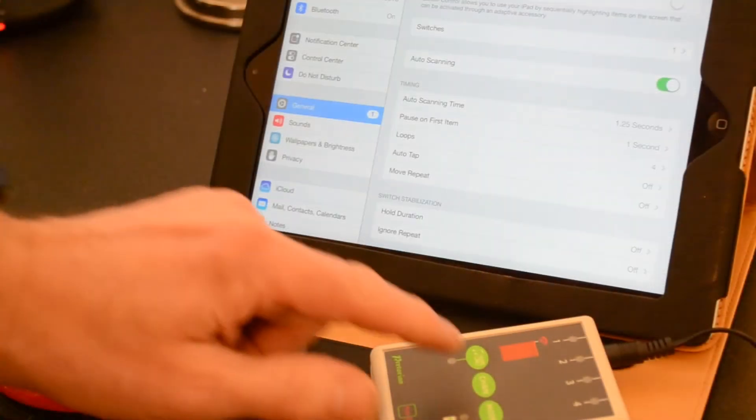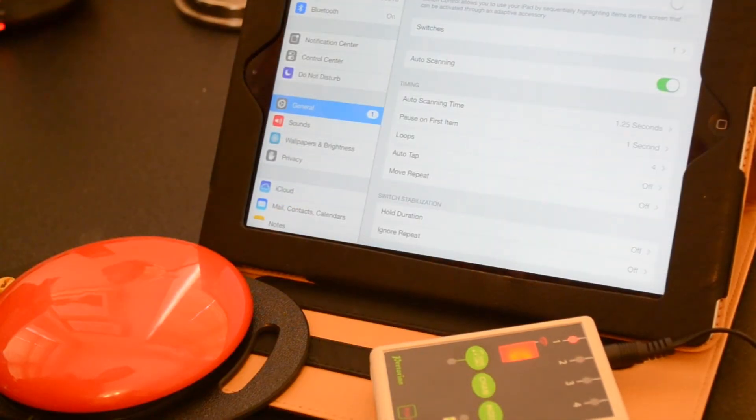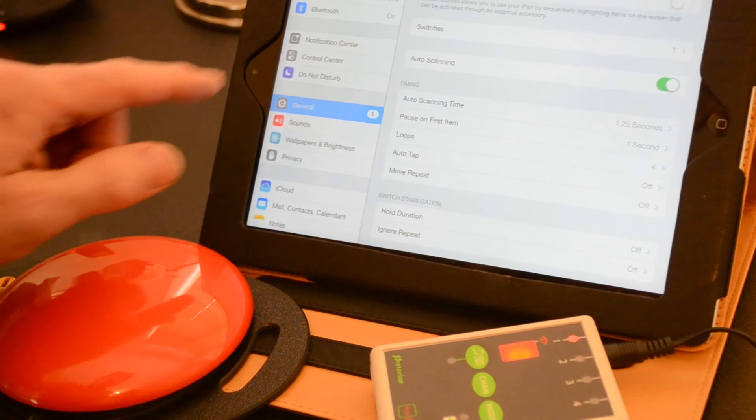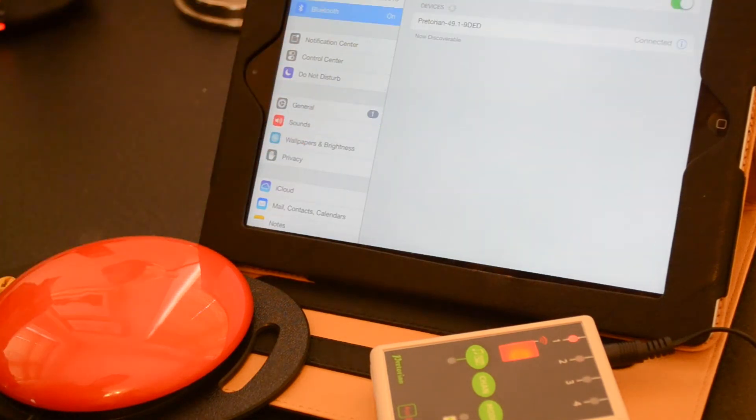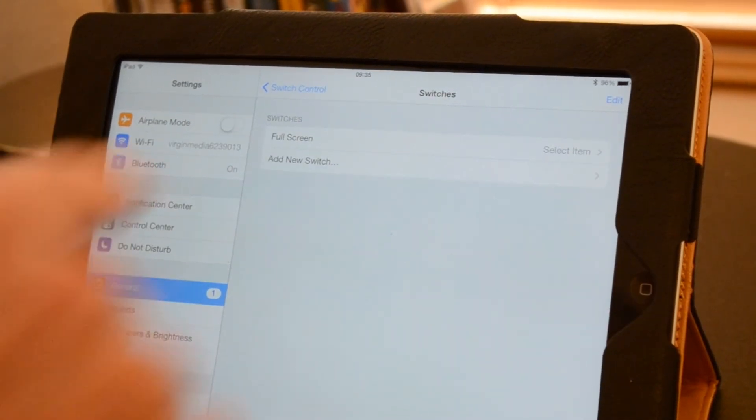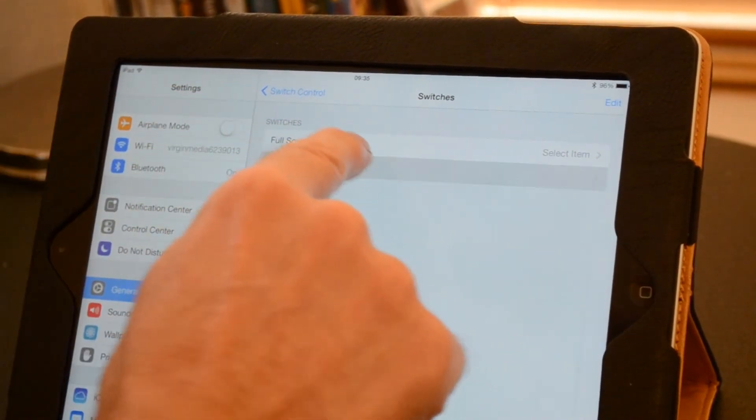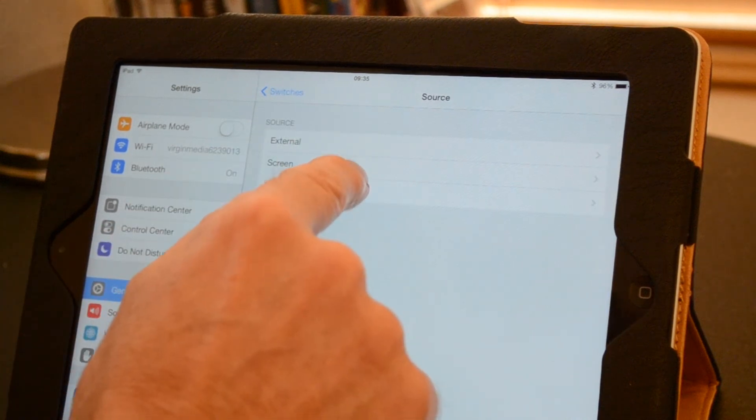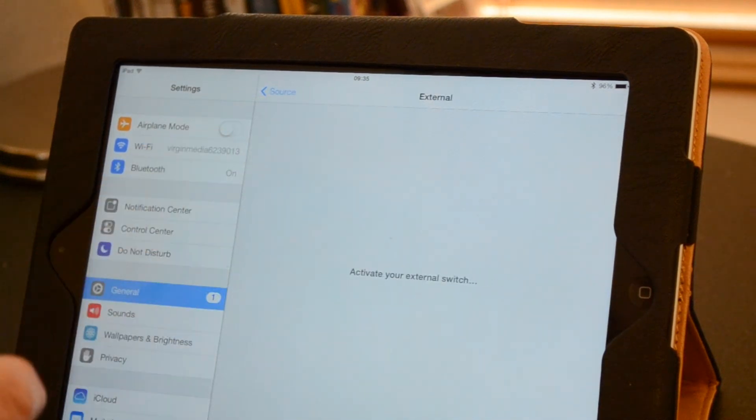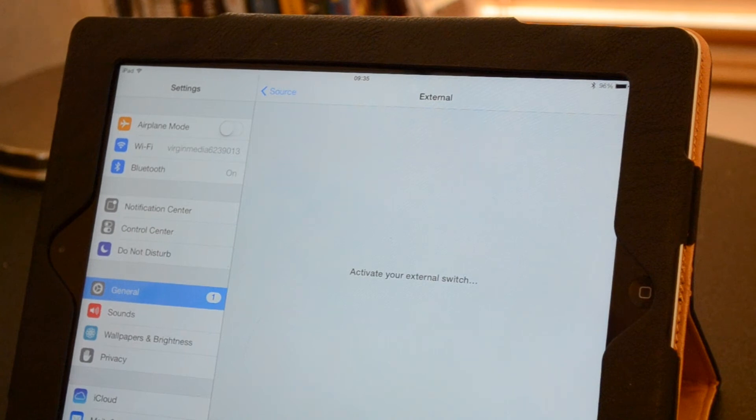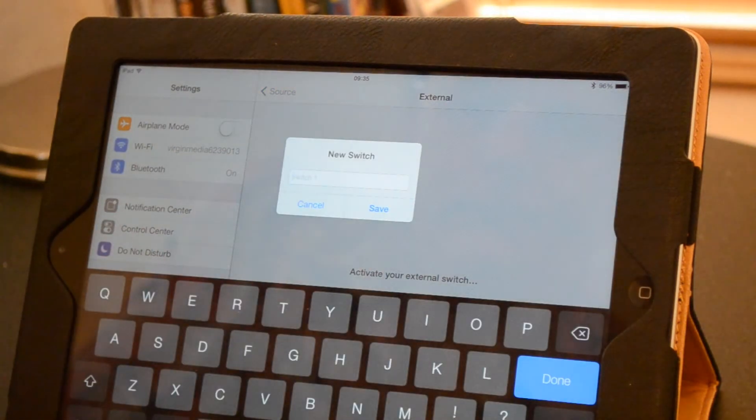External switches can be used but they require a separate connecting device such as this Bluetooth switch interface. These need to be charged up and Bluetooth connections are not always the most reliable. Setting them up can be a little complicated too.